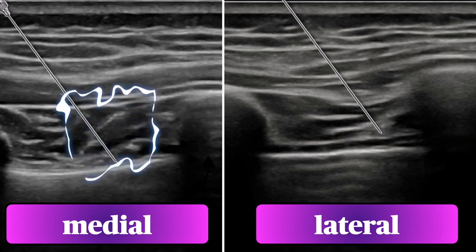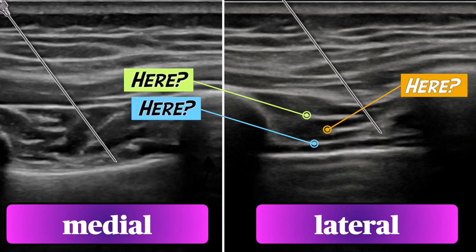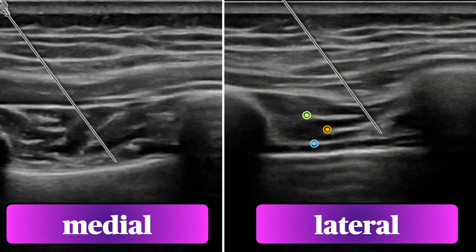Personally, I prefer doing these close to the midline because it removes the scapula from the equation. I also prefer to not try to find a nuanced intermuscular plane with my needle where I risk putting the local in the wrong space. I'm happy to hydrolocate my way down to the pleura safely, then inject my local there. It's very reassuring to see the pleural depression as an endpoint for my injection. I know the block will work for sure.